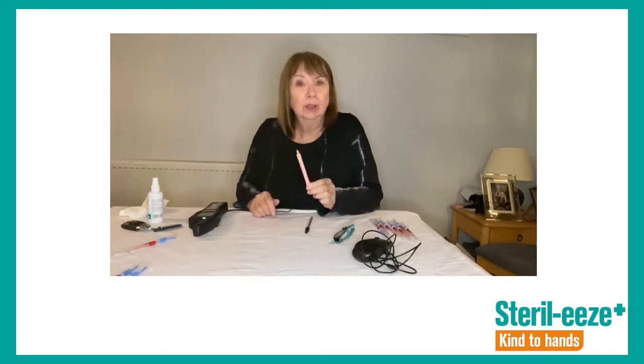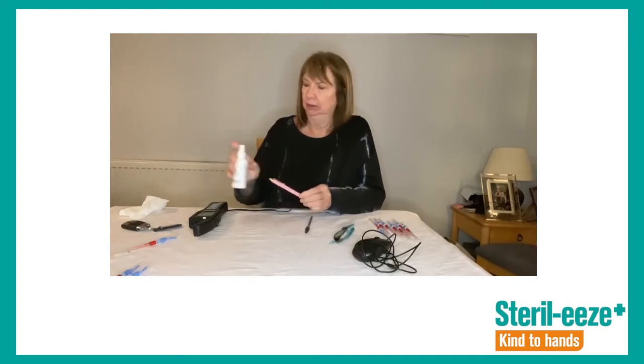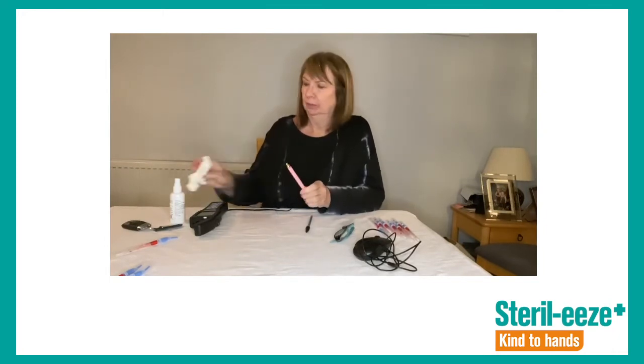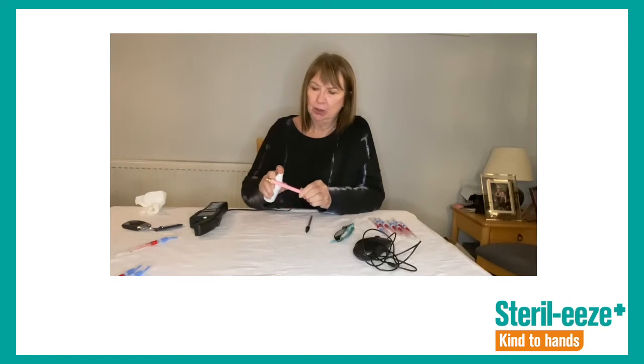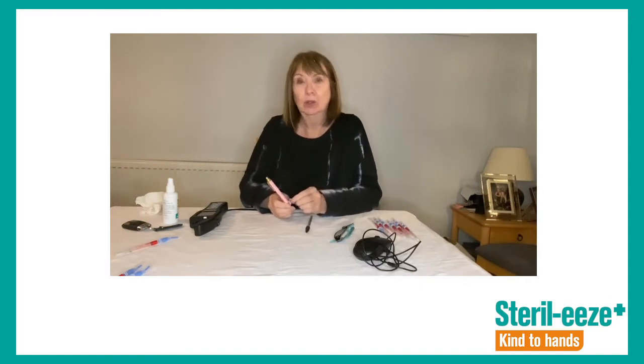So what I will do is I'm going to clean this now. I'm going to spray Steril-eeze on it. I want to give it a good clean to reduce any grime, and then I'm going to re-spray it with Steril-eeze. I'm going to leave this at least 30 seconds or 5 minutes, so I'll be back soon.